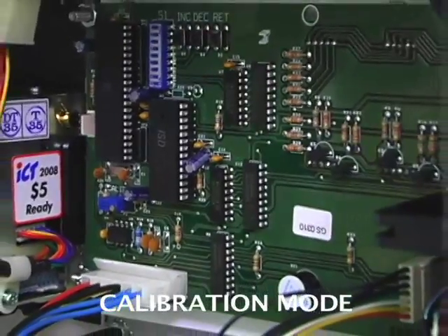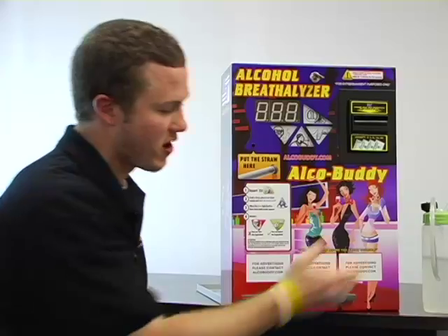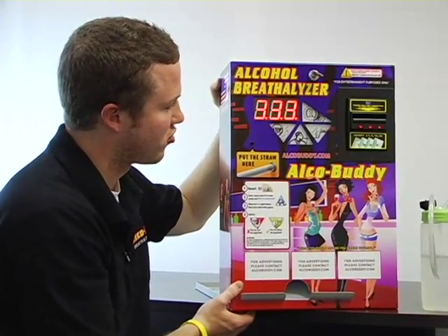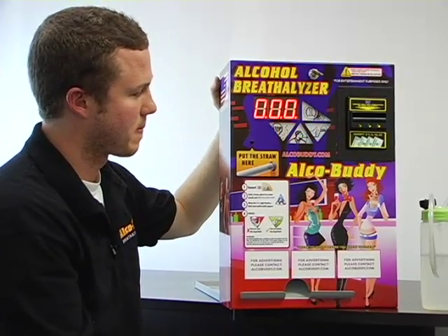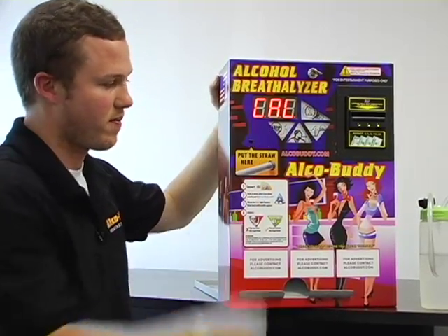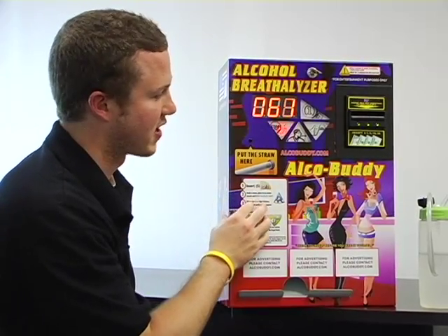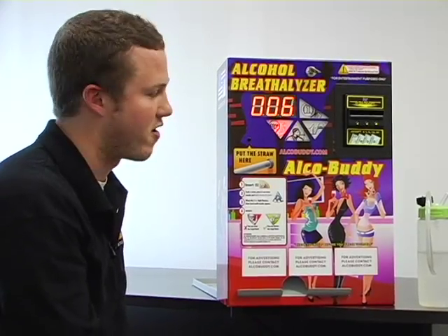Now I am going to show you the final step for the calibration. Now that we have created the solution and put the machine in calibration mode, let us start the machine up. You will see it flash 'calibration.' So every time we are in calibration mode, there is a 10 second countdown. We are going to miss the first one, but you will continue to blow as many times as necessary.